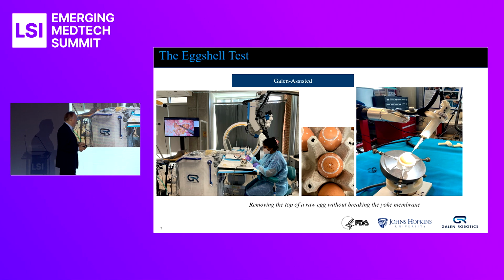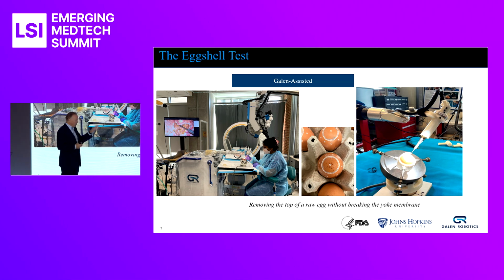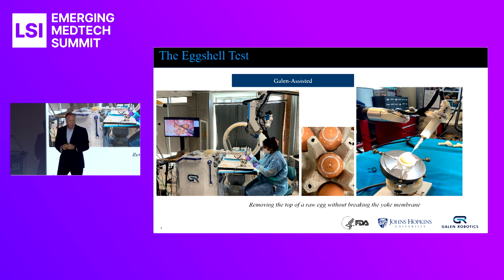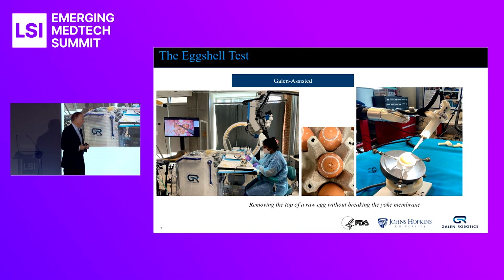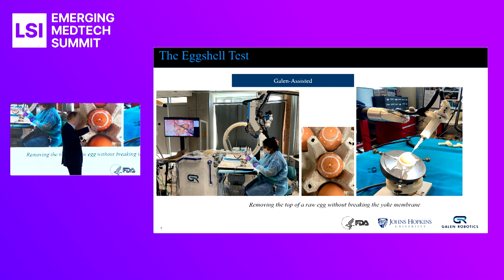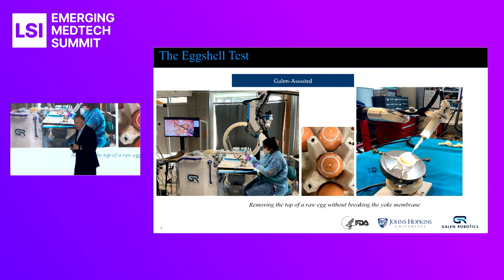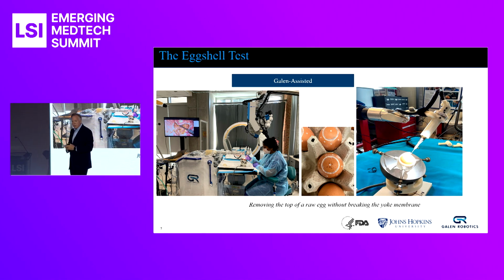Another drill that we have done at Hopkins, especially for the spine surgeons, they practice on raw eggs to carve the top of a raw egg off. It takes 5 minutes to do this, to carve the egg off. We can do it in 90 seconds with a sensor built, and that's a Stryker S1 drill that we're holding there.